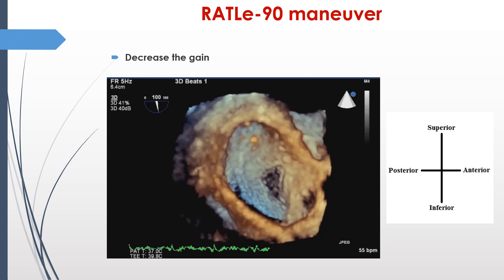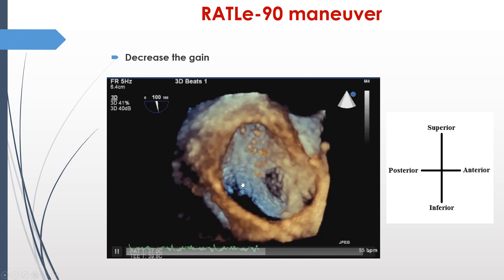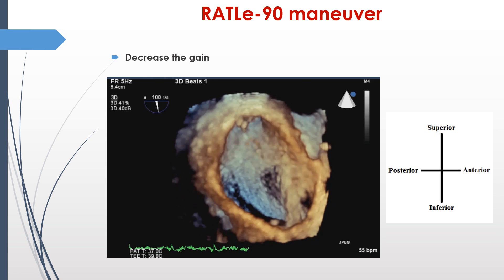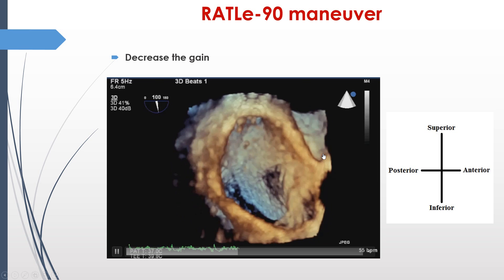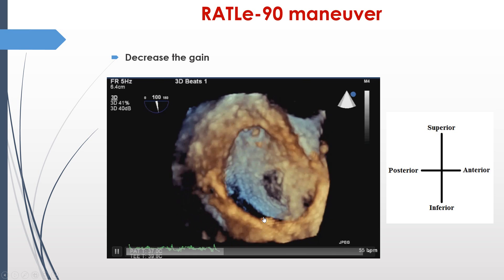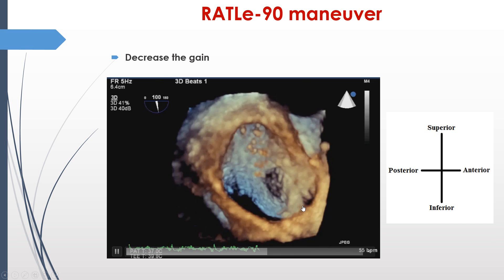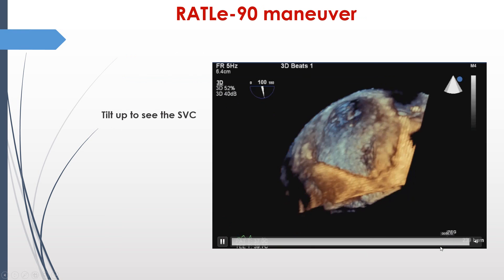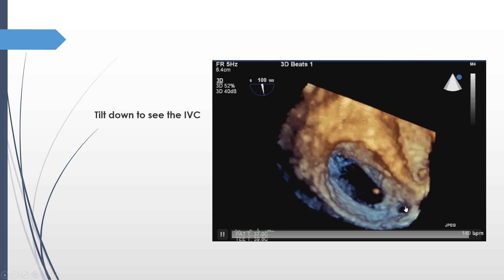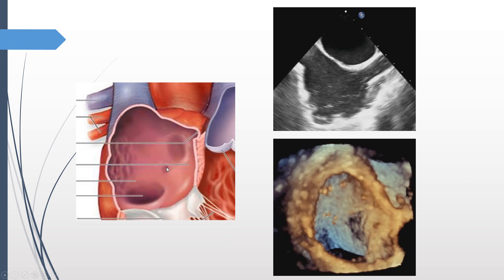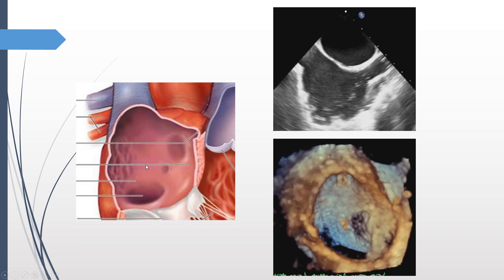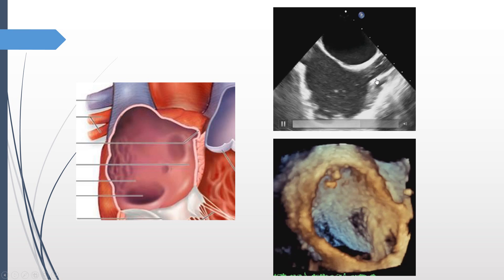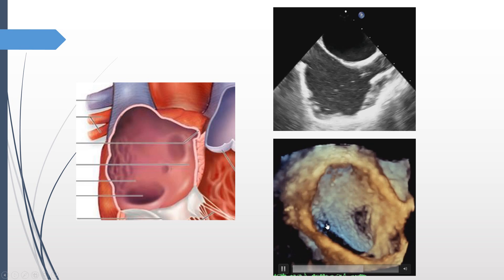Decrease the gain down and you will get a very clear live view — and this is very important. This is a live mode of acquisition, meaning you can monitor live events like septal puncture, septal crossing, or coronary sinus cannulation. Aortic valve is here, superior vena cava, inferior vena cava opening. This faint part is the fossa, Eustachian valve, coronary sinus. Superior, inferior, anterior, posterior. With some retroflexion you will get the superior vena cava opening; with some anteflexion you will see the IVC opening, Eustachian valve, and coronary sinus — very clear. In 2D, superior is pointing to the right, but the real superior is pointing superiorly. This is much more informative and easy to understand for everybody.